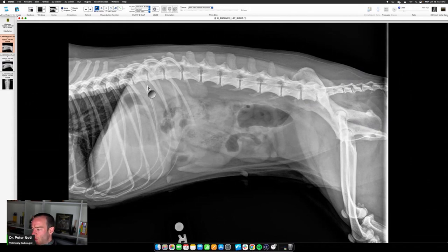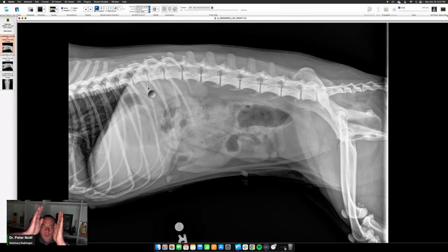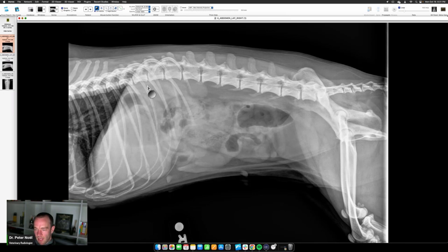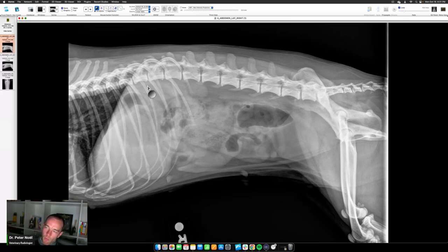When you put the dog down on the side, whatever side is touching the table has a little atelectasis — it retracts toward the hilum. So when you take the lateral view, it actually looks more dorsal because it's been pulled upward by that retraction.